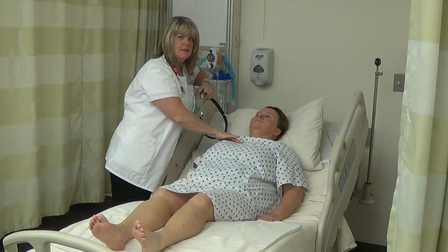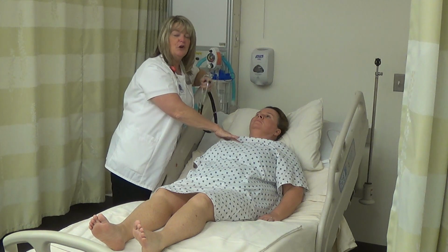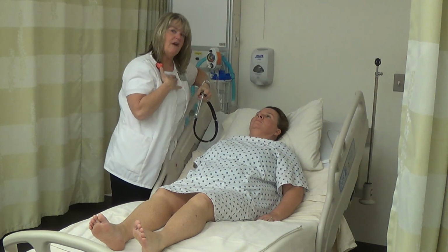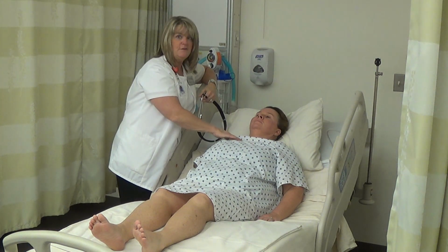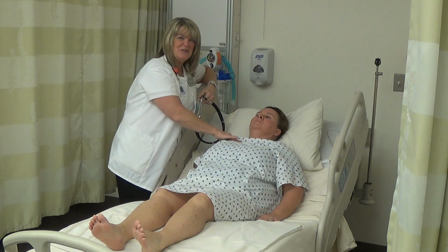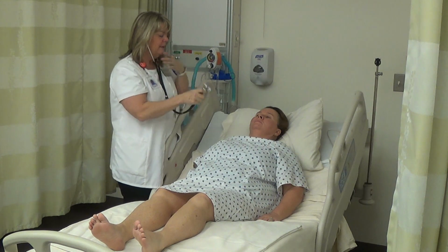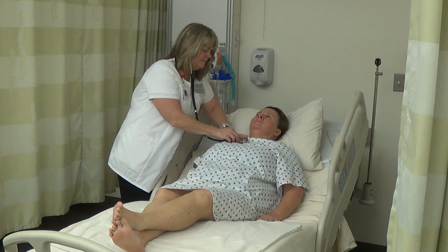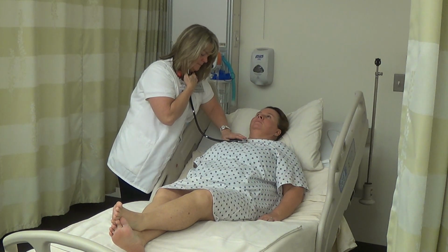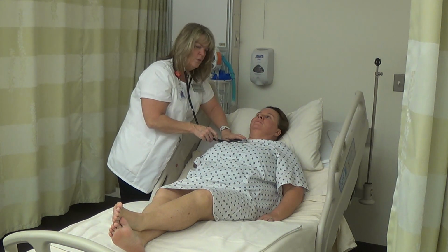And with your real clients, get right under that gown and be skin to finger contact, or with your equipment, with your stethoscope. You want that right on their skin, not through the gown, because that might alter your assessment findings. But for this video, we're going to maintain modesty and we will do it through the gown. So I'm going to take a listen. Second intercostal space, right at the sternal border. And we're listening to rate, rhythm, and volume. Those are the 3 characteristics of pulses.